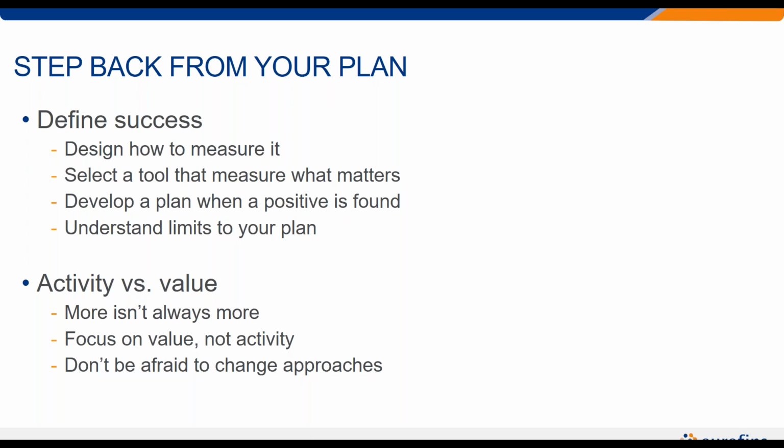So it's really important, even though it's very challenging, to go back and look at your data cumulatively. There could be a lot of really good information in there that helps you design a better program and, most importantly, helps you understand what your result means when you get a positive.